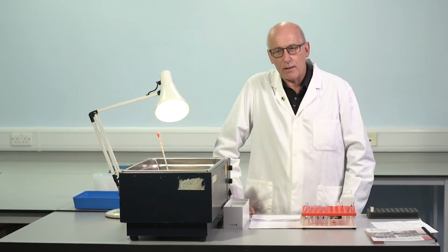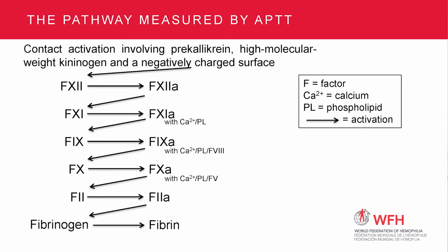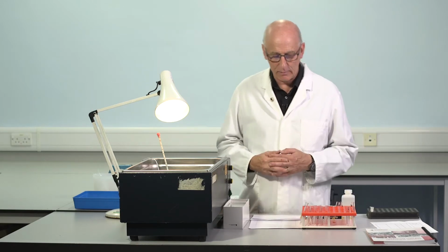The second important feature of our factor VIII deficient plasma is that it should contain normal concentrations of all the other clotting factors. So factor VIII deficient plasma we're now discussing has no factor VIII, but should contain normal concentrations of the other clotting factors, those factors relevant to APTT. Remember, the test is based on APTT. So it needs to have normal concentrations of contact factors, 12, 11, and so on, factor 9, factor 10, factor 5, prothrombin, fibrinogen. These should be at normal levels. The absolute concentration is not so important as long as it's at least 50 international units per deciliter, or a normal concentration of fibrinogen above, say, 1.5 to 2 grams per litre. And this is normally the case for the majority of commercial factor VIII deficient plasmas which are available.